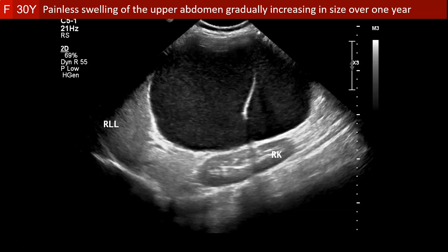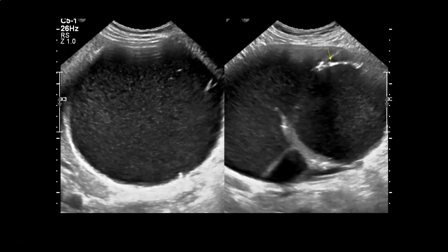Ultrasonography shows a cystic lesion with internal echoes and septation anterior to the right kidney and inferior to the right lobe of the liver. These two organs could be excluded as organs of origin for the cystic lesion, but ultrasonography could not determine the exact organ of origin. This frequently happens with large lesions.